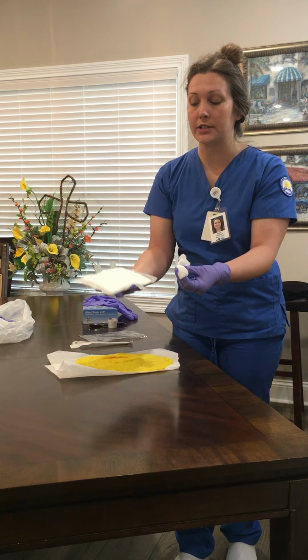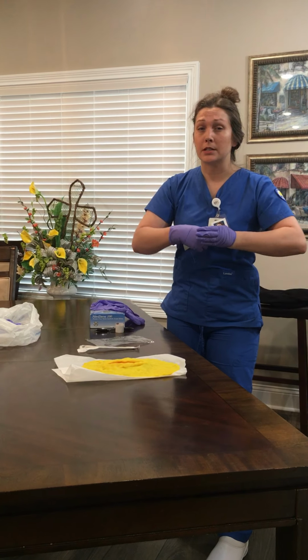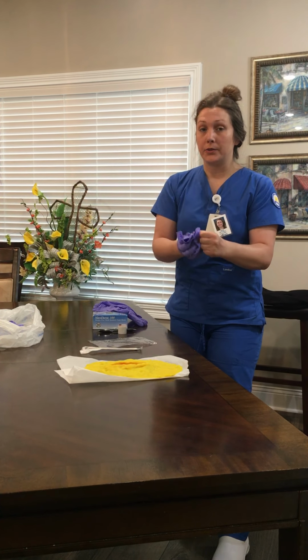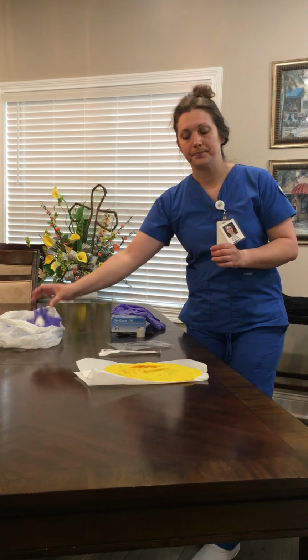So after you assess the dressing, you can discard it. Just roll it in your gloves. Again, verify your facility policy and procedures to note where you need to discard this. Does it need to go in the biohazard, or can you simply put it in the trash? So for now, we're just going to put it in the trash.